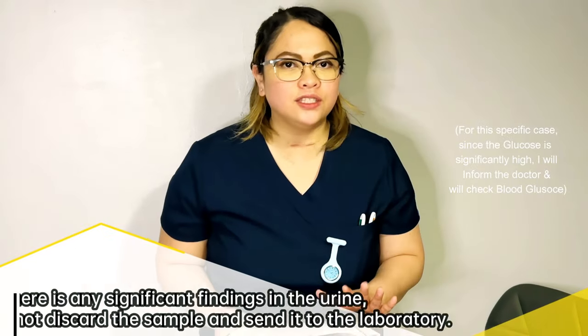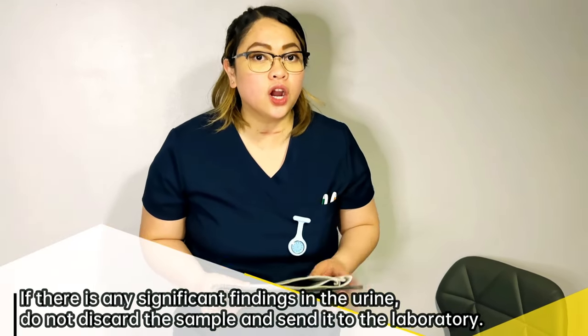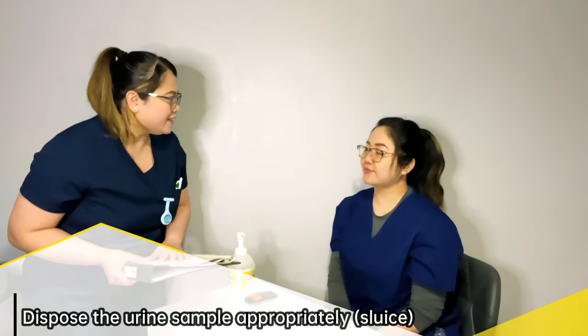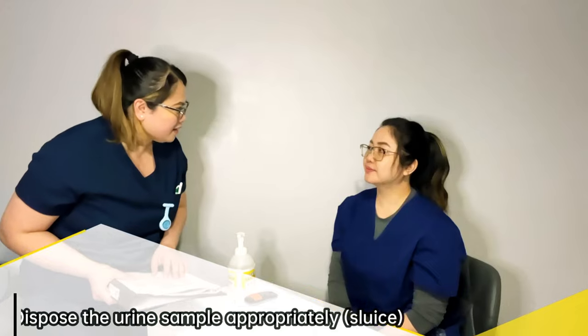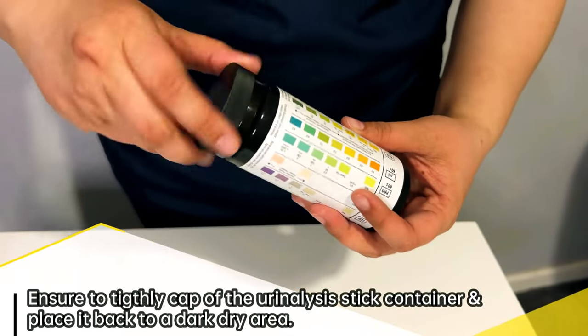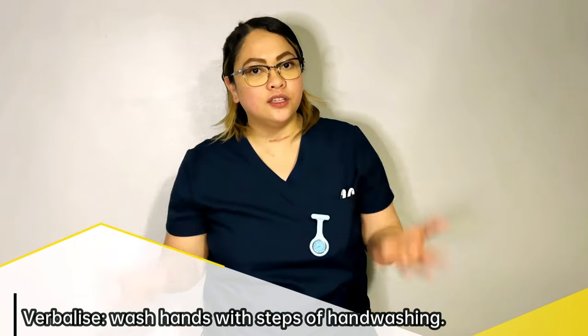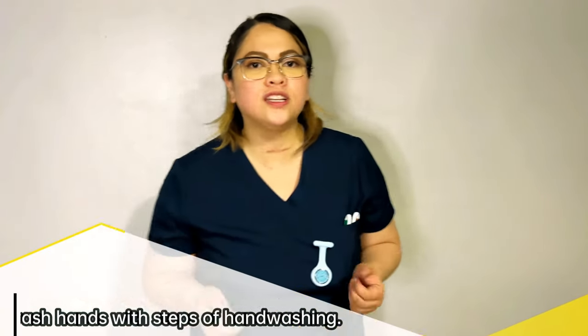If in any case there is no significant finding in the result, then you can discard the remaining urine in the sluice. Anyway, thank you for your cooperation, okay? If you need me, just ring the bell, okay? Thank you. Alright, I'm just doing my hands. And then nurses, after the procedure, just wash your hands using the steps of hand washing in accordance with the World Health Organization. And that's it.